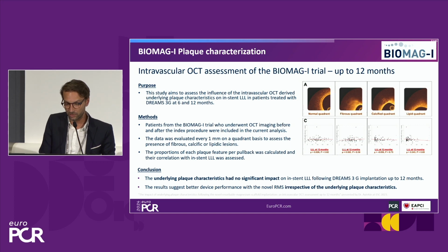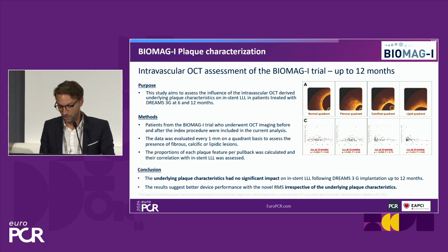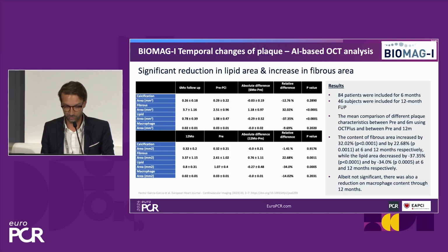The imaging sub-studies showed that the underlying plaque characteristics had no significant impact on late lumen loss with FreeSolve, suggesting better device performance. And although it was a low number of patients, vasomotion was restored at 12 months as well.